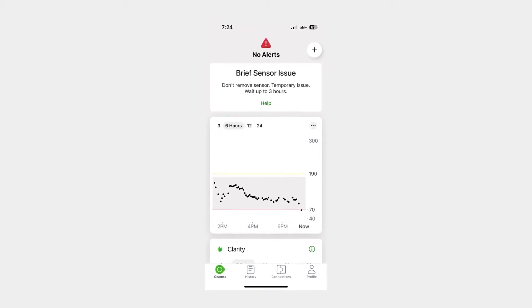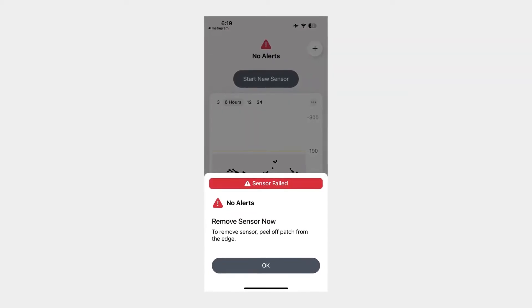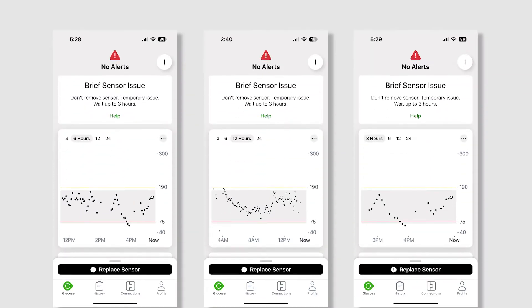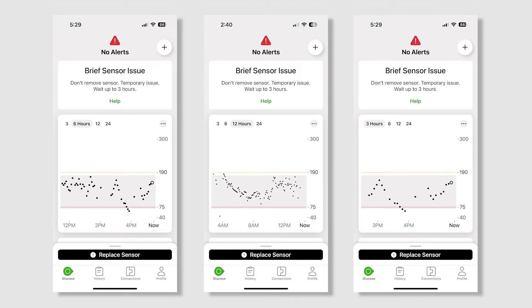However, connection issues are most definitely a problem here. I think I've experienced both older and newer models of the G7. Older models have very poor connection — I mentioned this in my one-month review, but I have a wider scope now. The connection issues can be so bad that my phone is in my right pocket, my sensor's on my left arm, and there's a brief sensor issue that is not so brief. This tends to happen a lot with a bad sensor. Here are a few graphs where you can see just how spotty looking these graphs are — one sensor was like day five or six and it was so bad I wound up taking it off and putting on a new one.